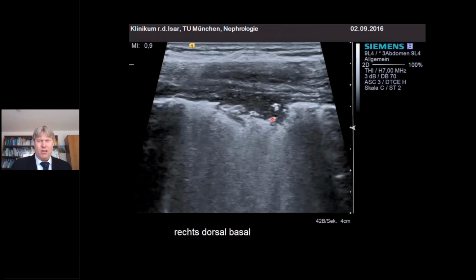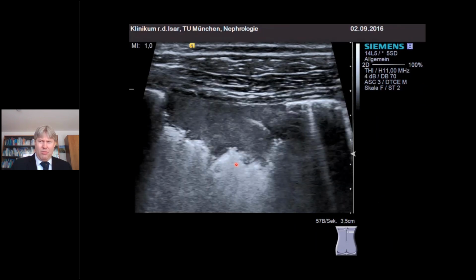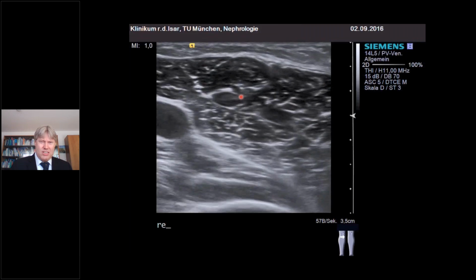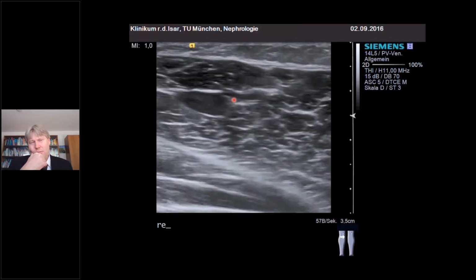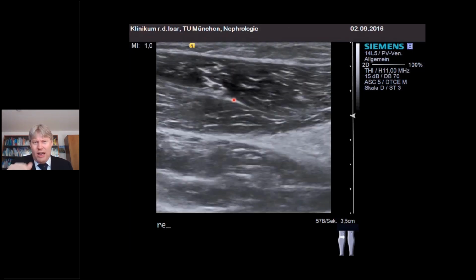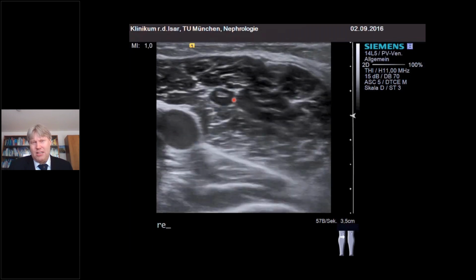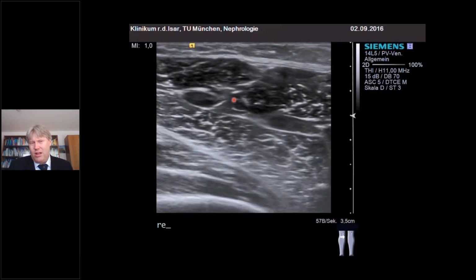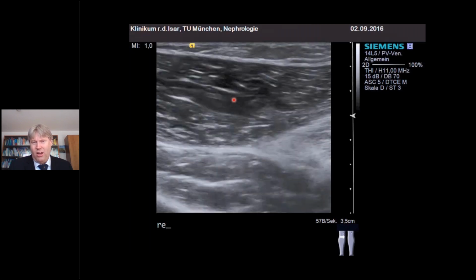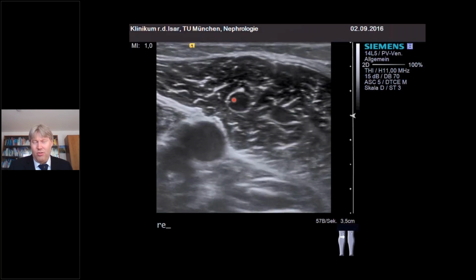Next I was seeing her in the hospital, and you can try to see what's going on here. With a higher resolution transducer, this is an infarcting peripheral lung embolism, and here you can see the muscle vein thrombosis. I felt a little reminded of this case when I started having a look at COVID patients. I'm not too sure whether the changes that we see in the fragmented pleura and the interactions, and we need more information from pathology to find out about that. I think this is also very interesting for the prognosis.